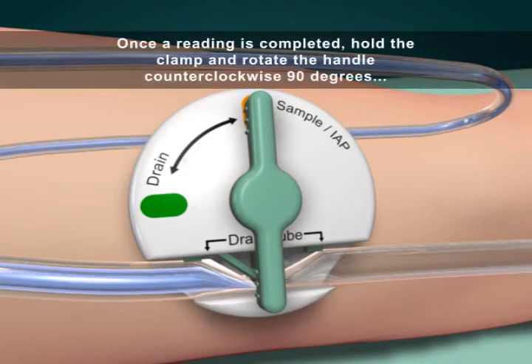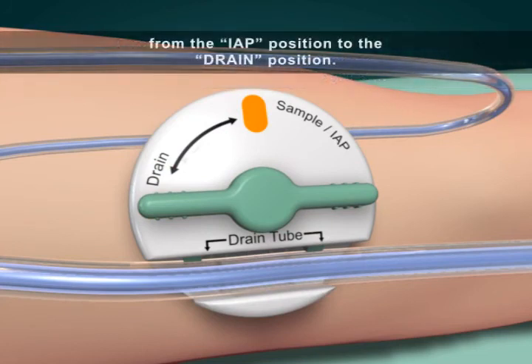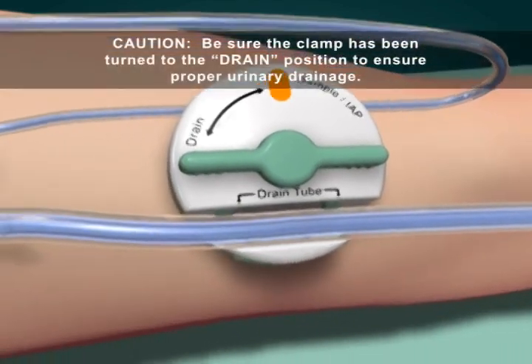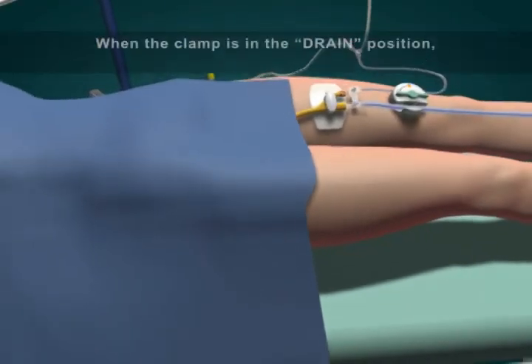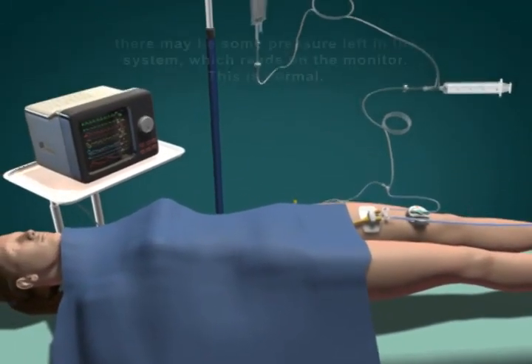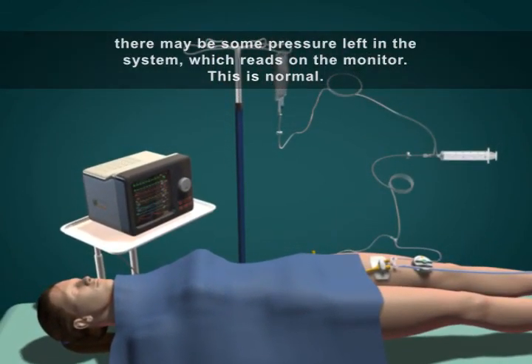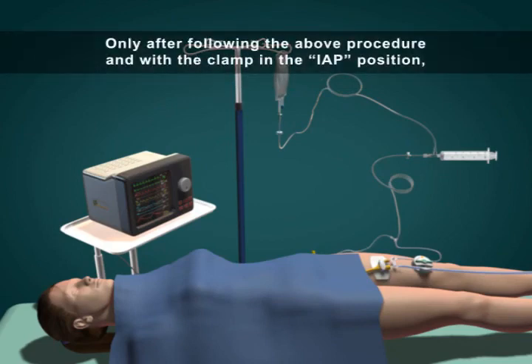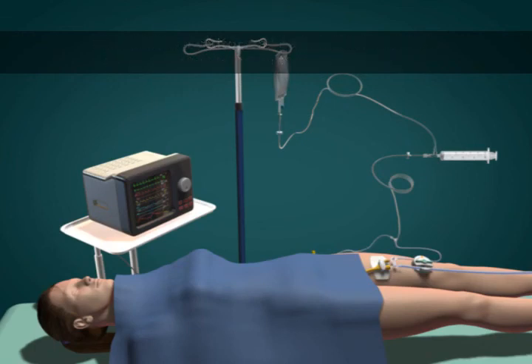Once a reading is completed, hold the clamp and rotate the handle counter-clockwise 90 degrees from the IAP position to the drain position. Caution: be sure the clamp has been turned to the drain position to ensure proper urinary drainage. When the clamp is in the drain position, there may be some pressure left in the system which reads on the monitor — this is normal. Only after following the above procedure and with the clamp in the IAP position should the monitor be read and interpreted. Record the volume of fluid infused in the Fluid I&O sheet.